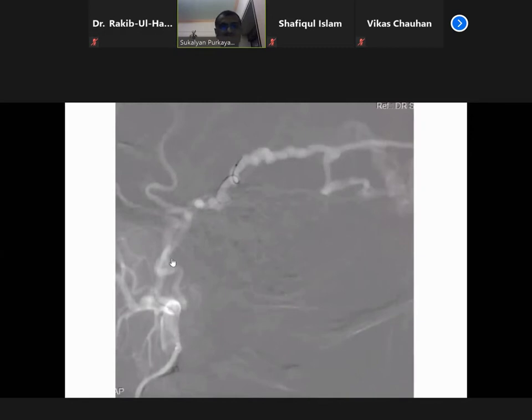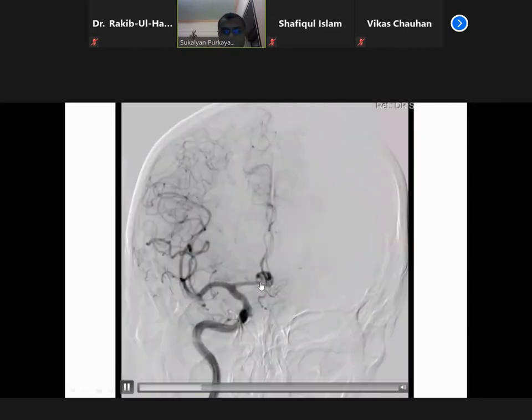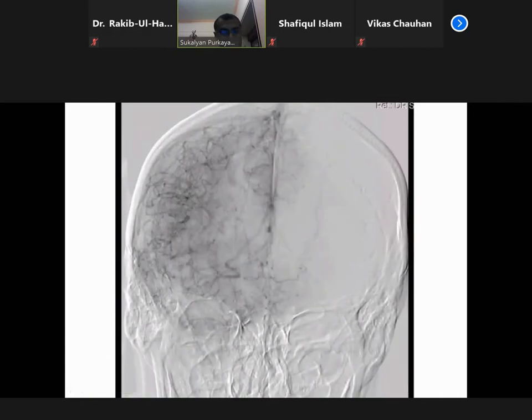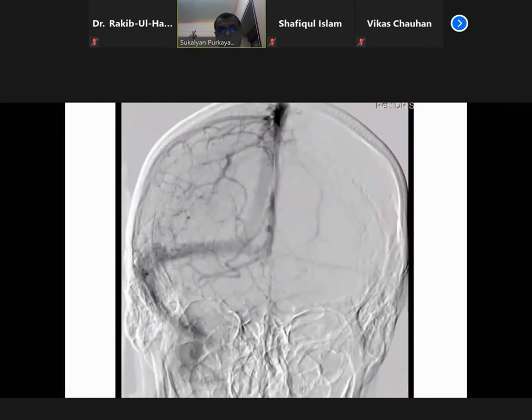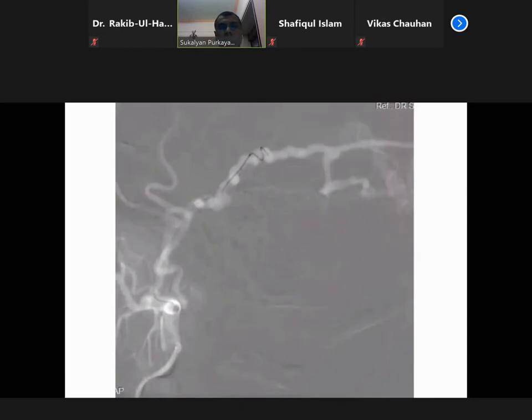Now here you see a combination of, I think, Neuron through Neuron Max, or probably this is Cat5. You can take Navien or any other catheter which goes a bit distally for stability. And this is again a Marathon and Traxcess combination.